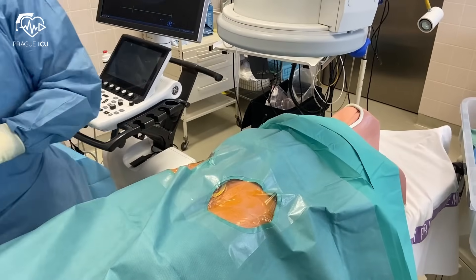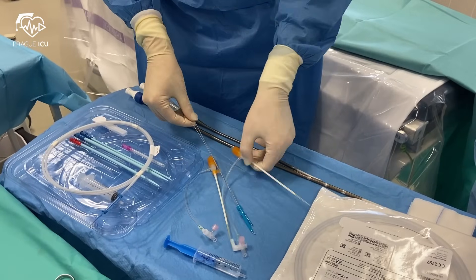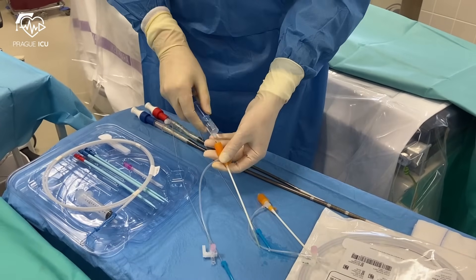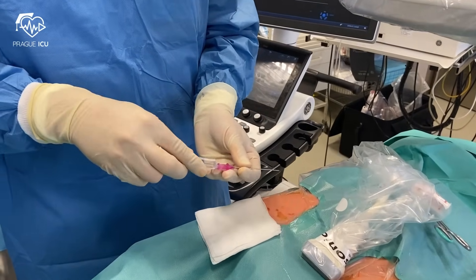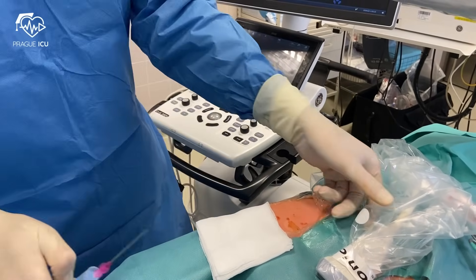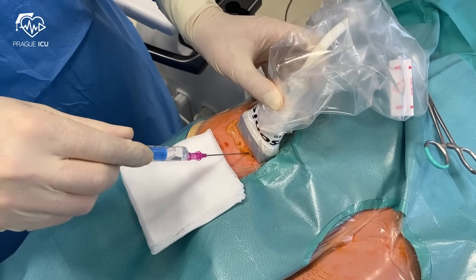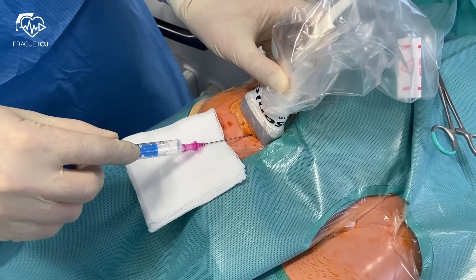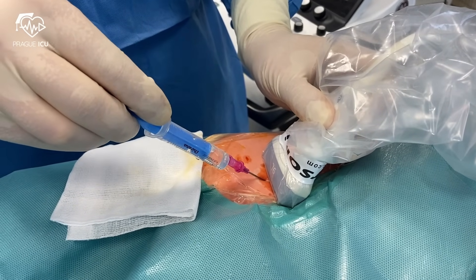For an elective procedure you can spare longer time with a thorough manual disinfection. Then you can put the large fenestrated drape on. In case you use X-ray, an assistant will help you putting on the sterile X-ray cover. For the initial vessel cannulation we will use the 7 French rigid sheaths, which might be helpful in securing the cannulation sites in patients with difficult vessel access in the groin. Some operators use just the introducer needle for the puncture, but we prefer to use both needle and syringe with a 5 ml syringe for great maneuverability. All cannulations need to be performed under ultrasound, as this approach minimizes the risk of complications. Try to approach the skin not at 60 degrees but at 30 to 45 degrees angle, as this will facilitate further dilations and insertions of the large bore cannulas.